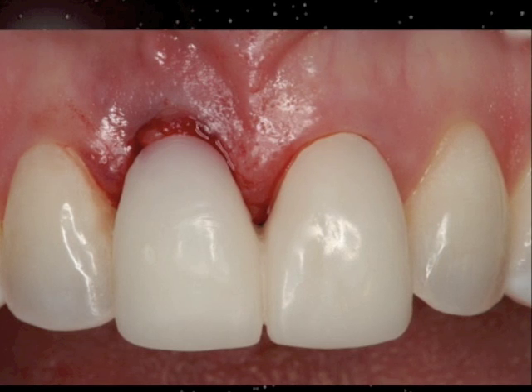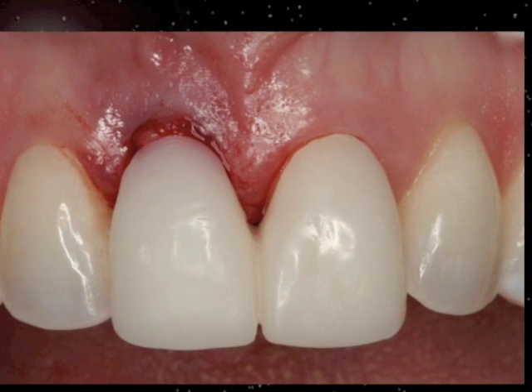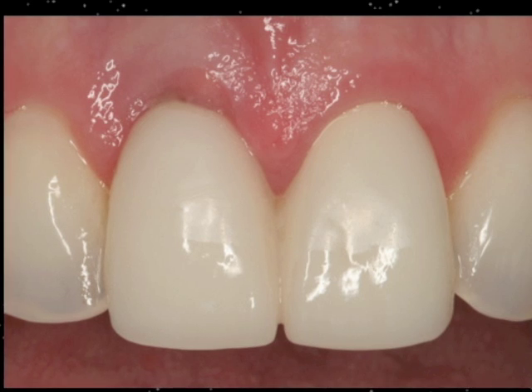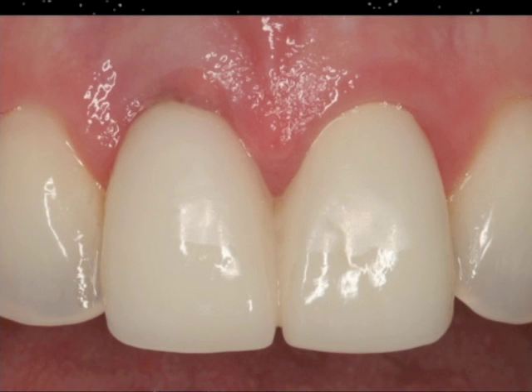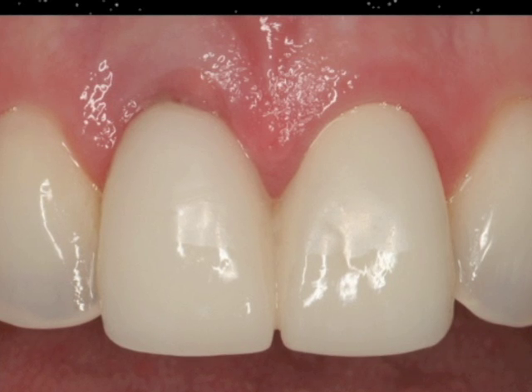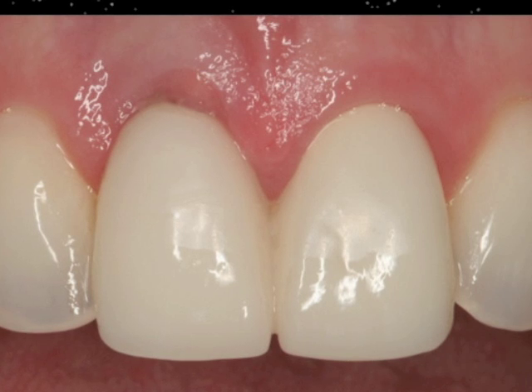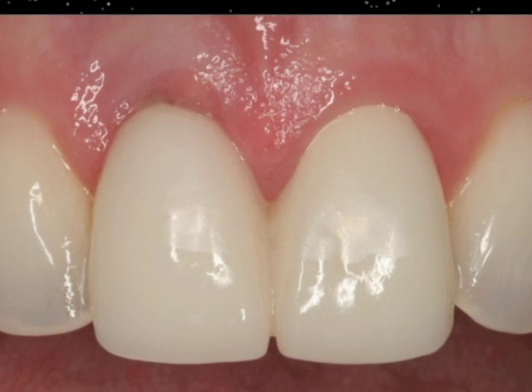Here you can see the day of implant placement and the provisional restoration placed on the implant and the natural tooth, and what healing occurs over several months. When patients get these two new front teeth and realize how great they're going to look, they oftentimes want to perk up their smile with ancillary treatments such as bleaching, which you have time to do because these temporary restorations will sit on the implant and the natural tooth for two months before transitioning into porcelain final restorations.